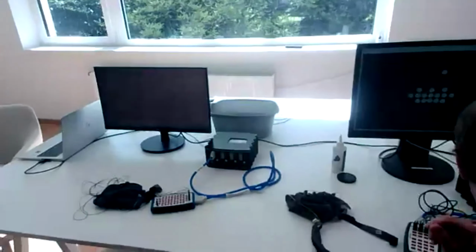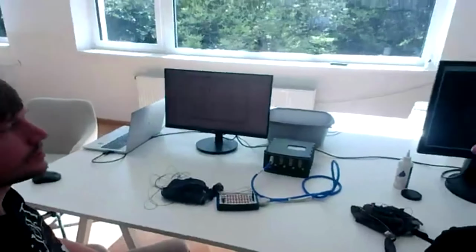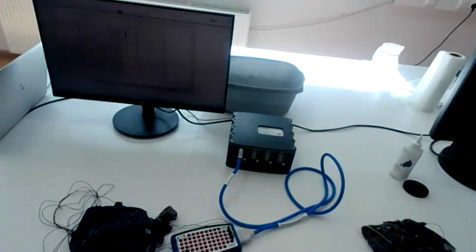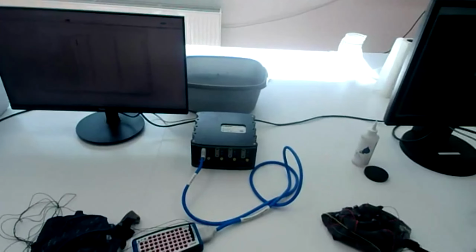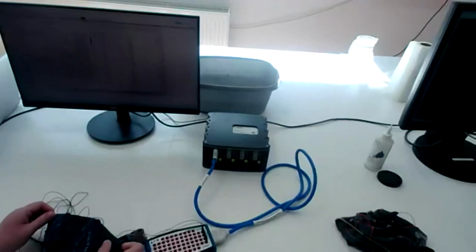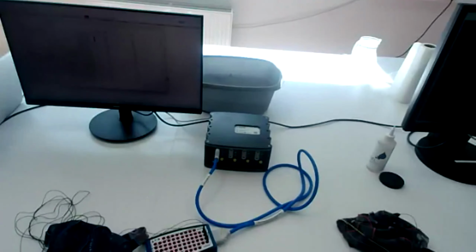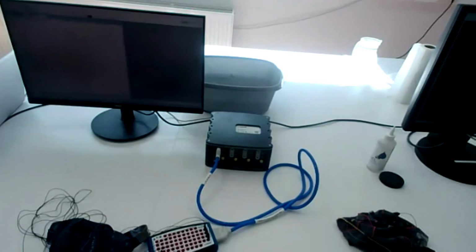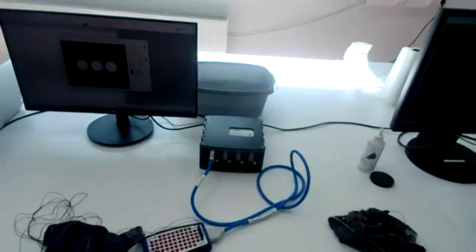It will be hard to see on the other screen, but Slobodan is going to put the electrodes, so ground, ref, and 3 electrodes, and everything is already selected. So now let's open the impedance check. The same way that I did, closing the configuration and now going to the tools and impedance check. So we will have the impedance check of the 3 values.